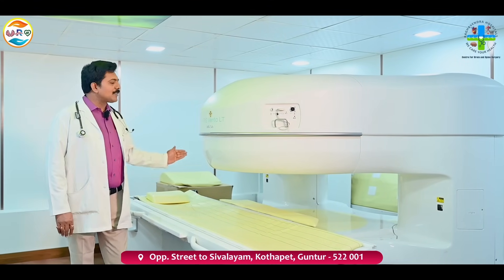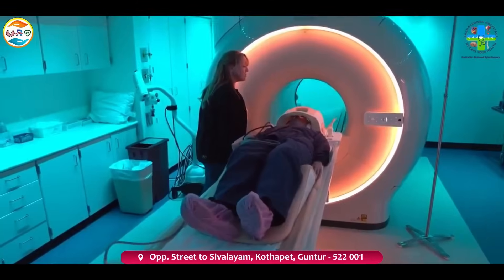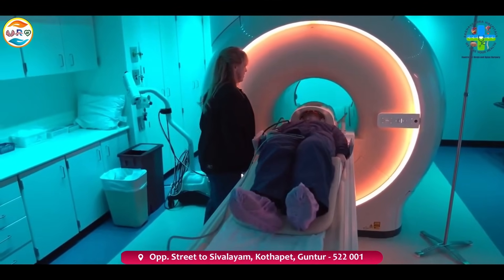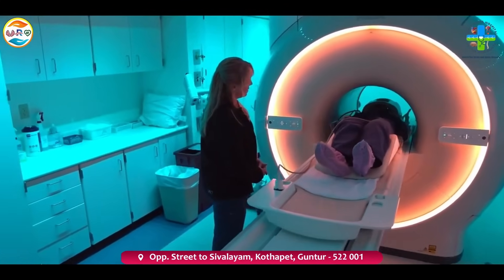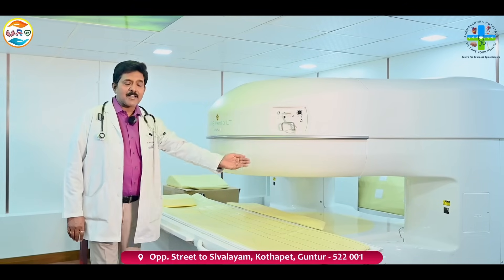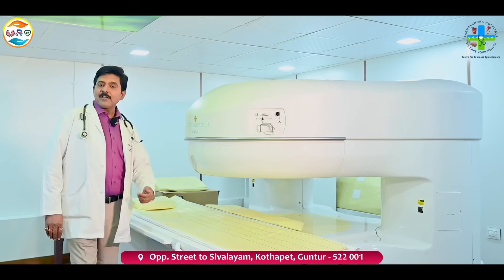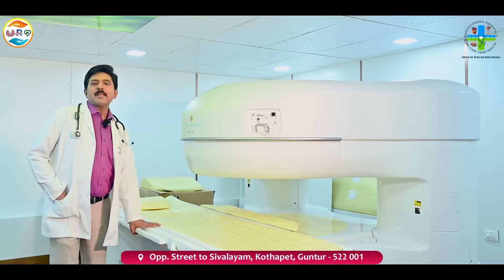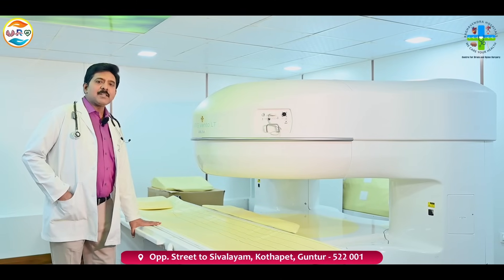Open means it is open from all three sides. Unlike the conventional MRI, where all sides are encircled in a gantry and the patient will have a lot of fear while entering, here the patient won't have any fear. All three sides — front, sides, and lateral — are fully open. This is the table where we make the patient lie down, and this table is movable.